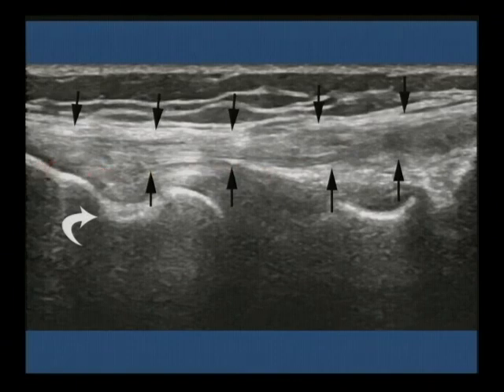And you can see here's another coronal cone down image. Here's the notch for the popliteus. Here's the fibular collateral ligament arising just above the notch for the popliteus. It's going to come down, and then as you come halfway down or two-thirds, you often lose it from anisotropy, and sometimes you just can't seem to get it in the plane the way you want it.